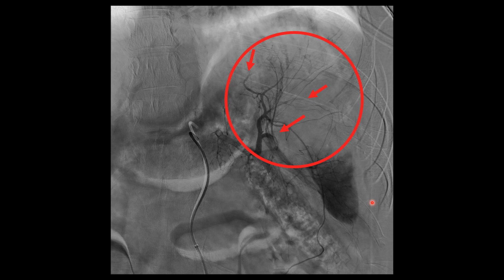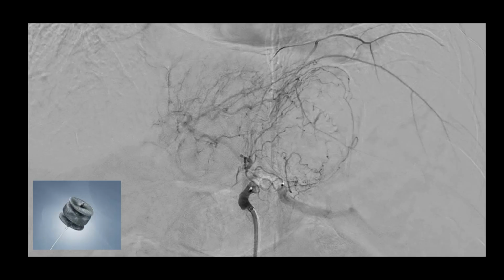So another option we have is we can just use a vascular plug proximally within the splenic artery, decrease the inflow and the pressure so that the bleeding can stop. And then, you know, as long as you do it proximally, you don't cut off all the other small collateral flow to the spleen. So hopefully what little spleen is still being perfused can continue to be perfused, and maybe even some of these can recover. So that's exactly what we did.